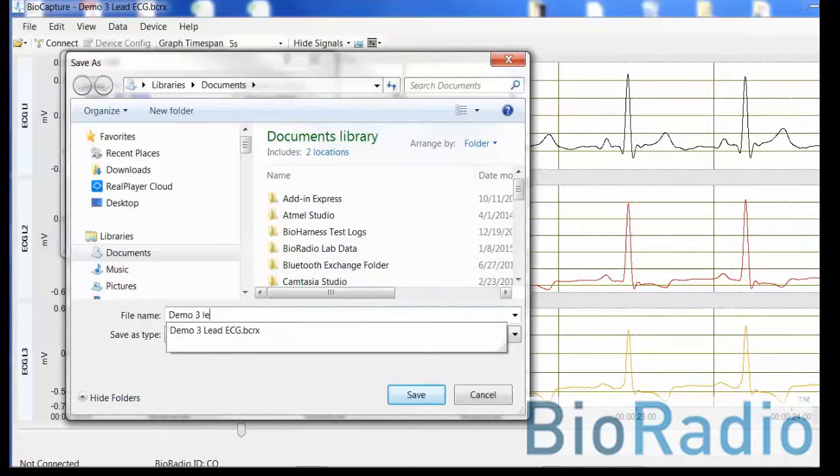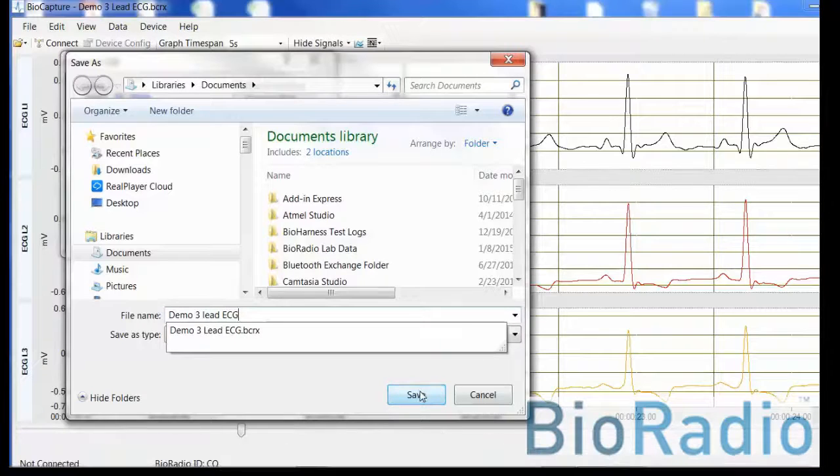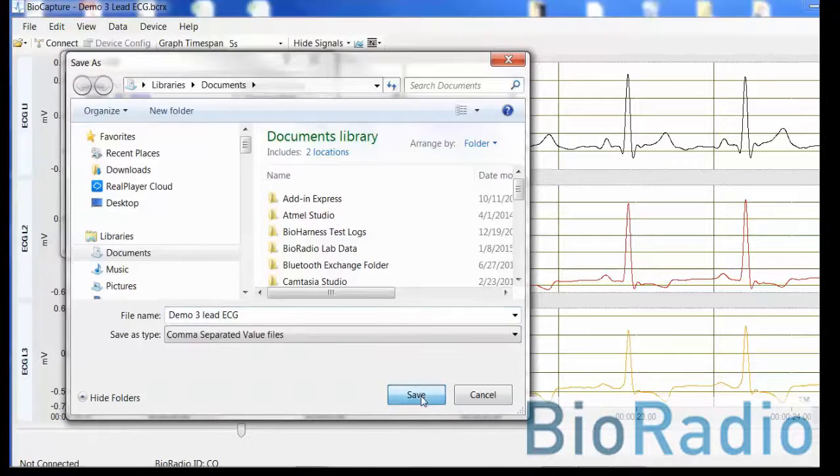Again, you identify the location, the name of the file. You select save.